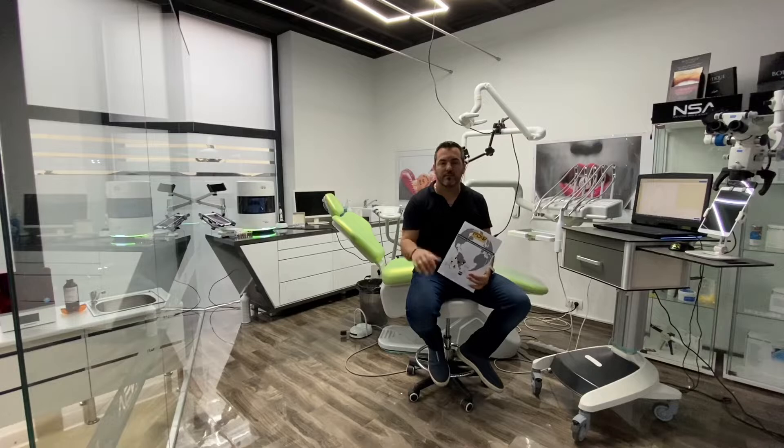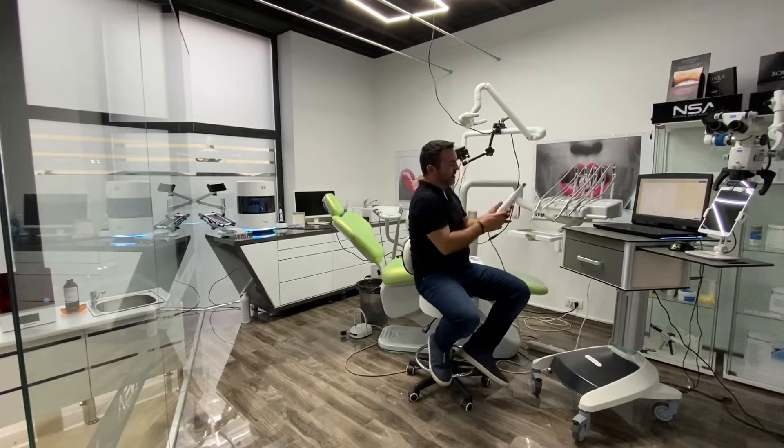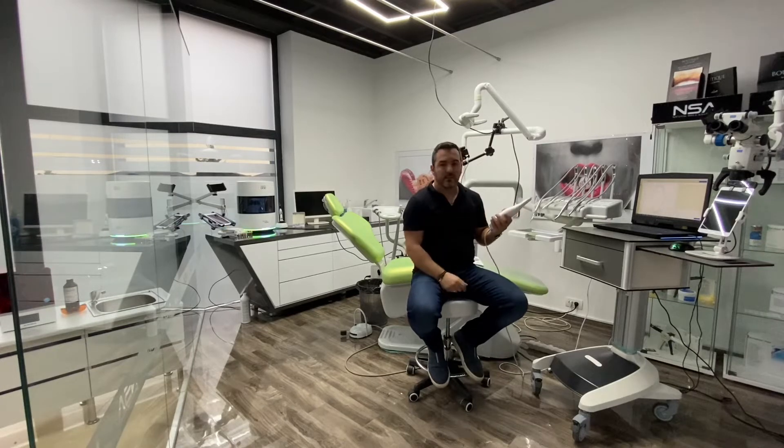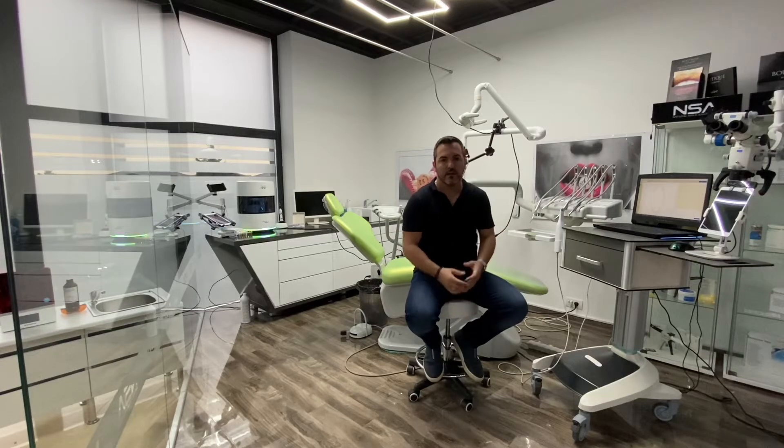The first step should be to have an intraoral scanner, like this one we have here. This is the MEDIC i500 — it's my personal choice, one of the best scanners out there right now. I've been using it since it appeared on the market and I have tested it from every aspect: non-prepped veneers, prepless veneers, normal veneers, crowns, bridges, and all-on-4 retained restorations. It has amazing features inside and with every update it's getting better.